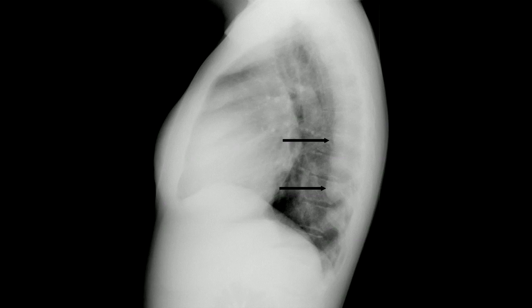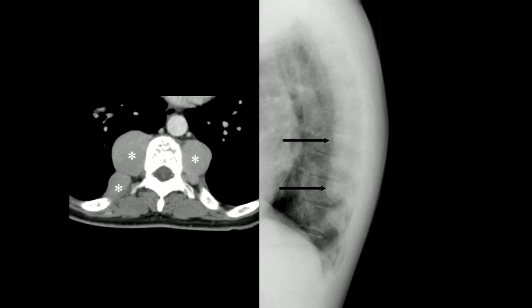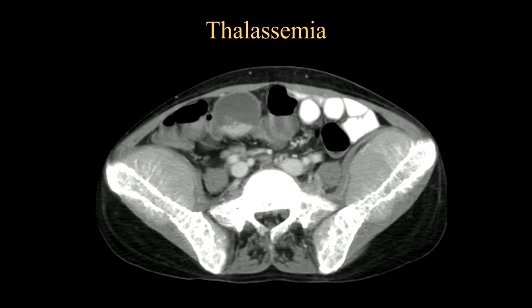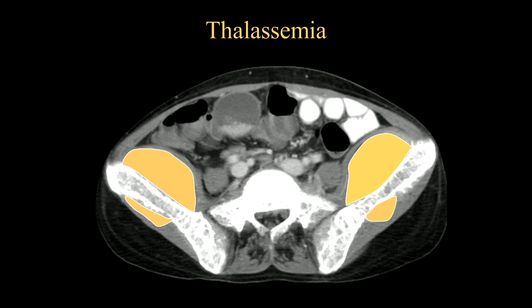The perivertebral masses are actually more obvious on the lateral view of the chest X-ray. On CT scan, you can appreciate why — there are lobulated soft tissue masses very classically around the thoracic spine, but they can also occur anywhere in the body, including the presacral space. You can also have enlargement of your liver and spleen. In another patient with thalassemia, you can see red marrow extramedullary hematopoiesis coming through the iliac bones — a classic hair-on-end appearance, but happening in the iliac regions rather than the skull.